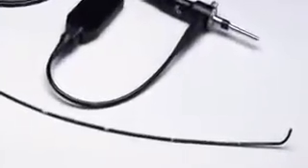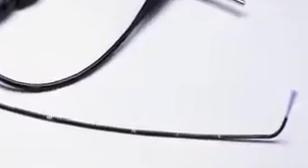The term endoscopy refers to a special technique for looking inside a part of the body using an endoscope. An endoscope is a long, thin, flexible tube with a tiny video camera and light on the end. By adjusting the various controls on the endoscope, the gastroenterologist can safely guide the instrument to carefully examine the inside lining of the upper digestive system. The endoscope provides a high-quality image that gives a clear, detailed view of the examination area displayed on a TV monitor. In many cases, an upper GI endoscopy is a more precise exam than an X-ray.